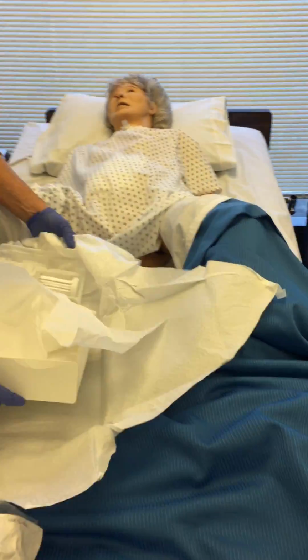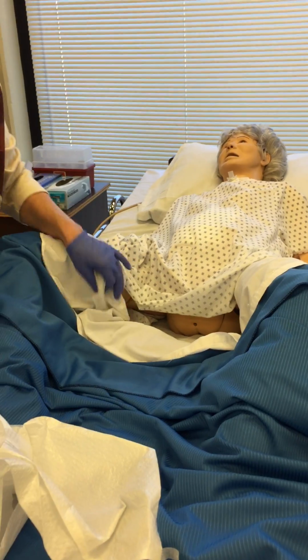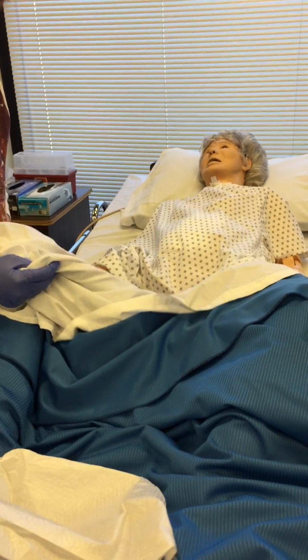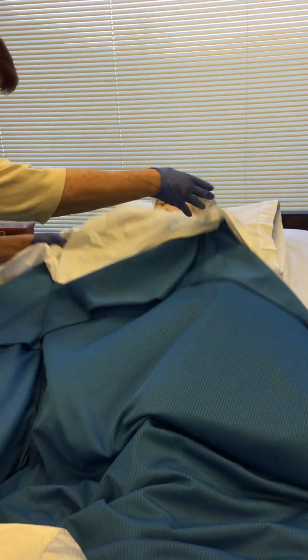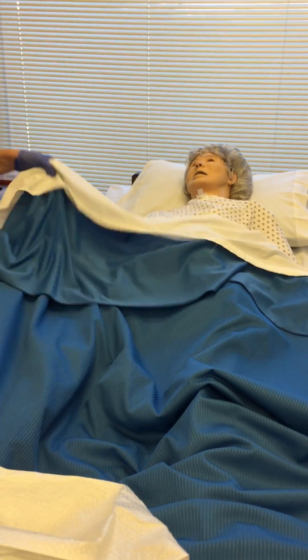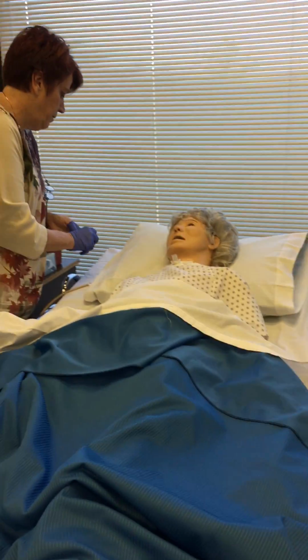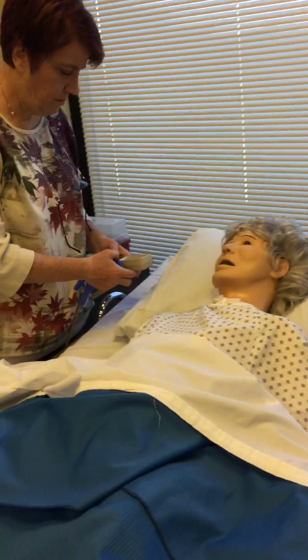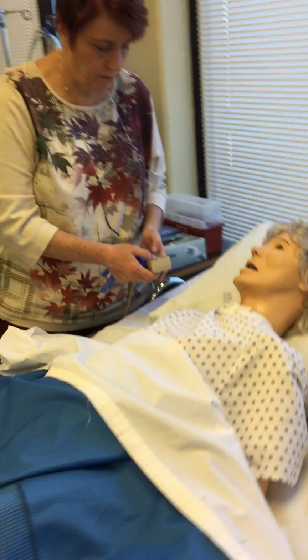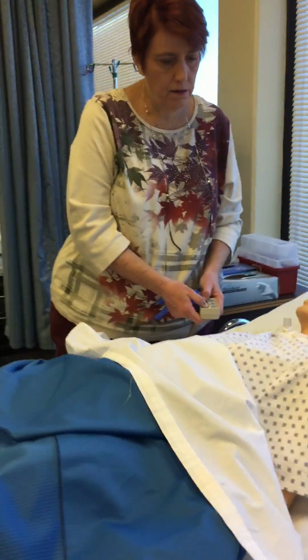Get rid of all your garbage. You okay, Ruth? That wasn't too bad, was it? And lower bed.